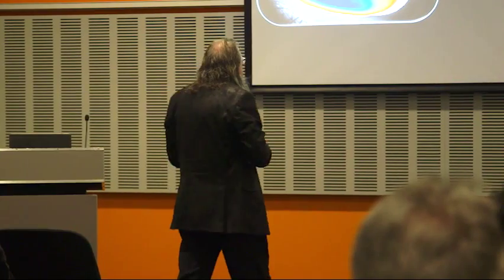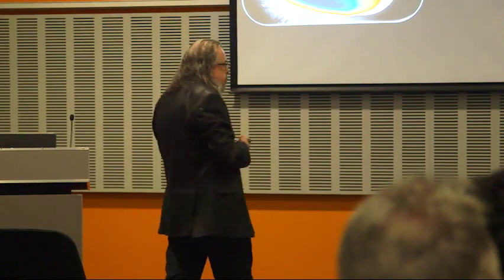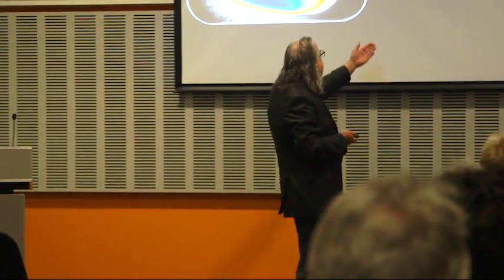But perhaps the greatest thing that I personally have learned from the eye surface profiler is the amount of toricity that is present in the sclera. You see, in those 40 patients, or 80 eyes, that we measured, what we found was that the average amount of scleral toricity was around 4 diopters, 0.80 millimeters. That is the average amount of toricity.